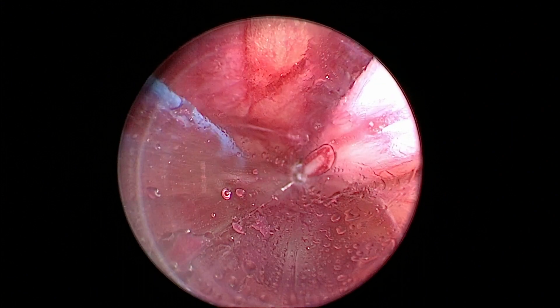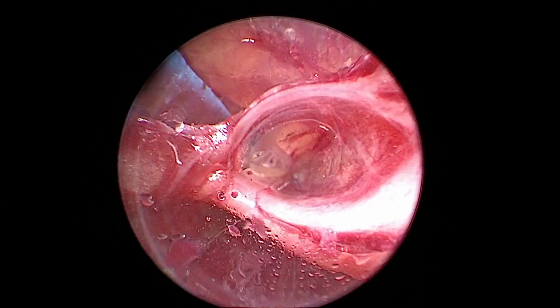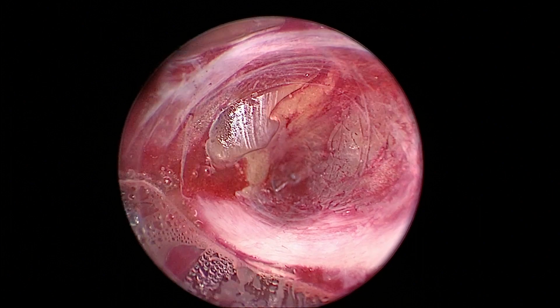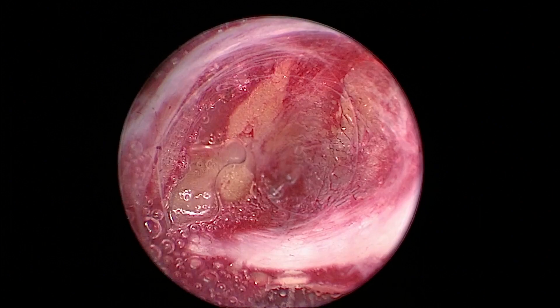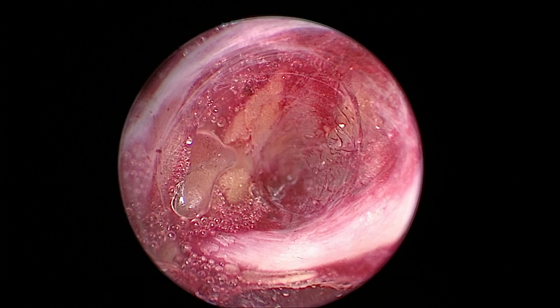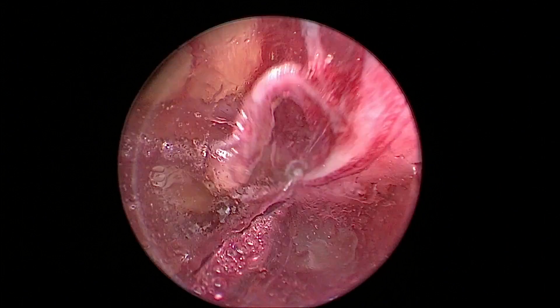Here's another large branch, and this is actually a new user — someone that hasn't harvested vein before, only done a couple cases. She really likes the pullback as a preferred method. It's a little bit easier for her to do having no experience with EVH or the device.